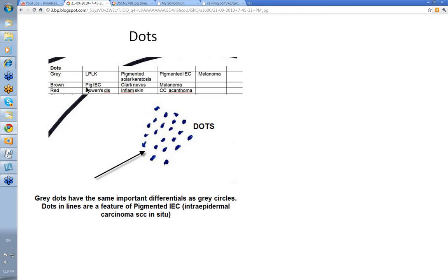For brown dots, the differential is pigmented intraepidermal carcinoma or Bowen's disease, Clark nevus, or a melanoma. And for red dots: Bowen's disease, inflamed skin, things like psoriasis, or a clear cell acanthoma.